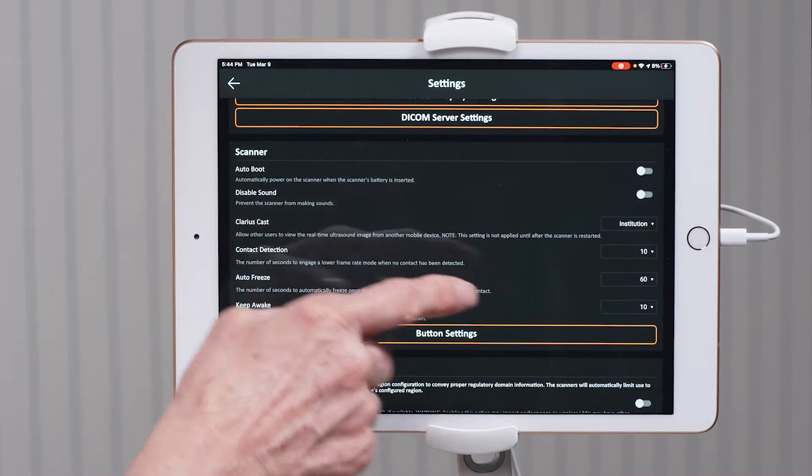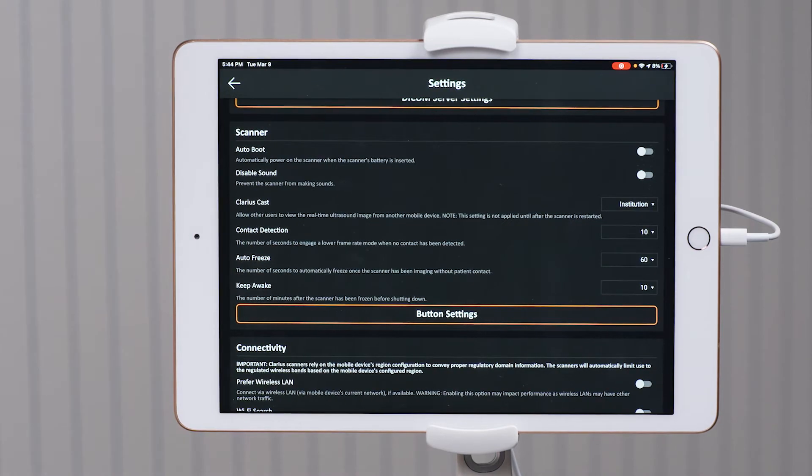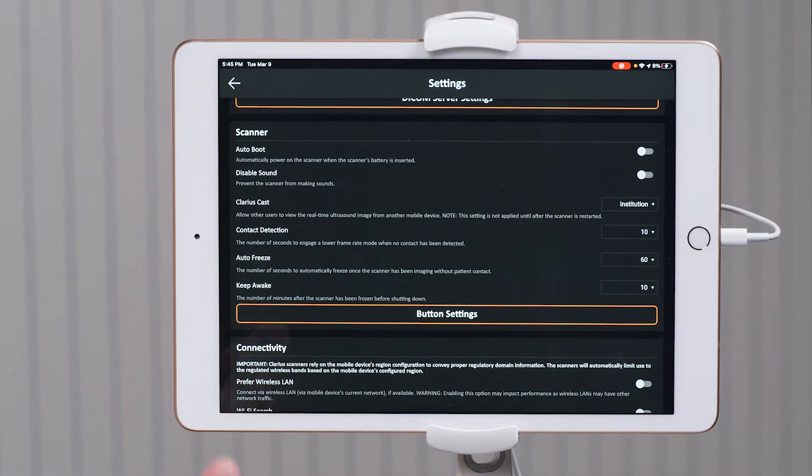I'm going to continue to scroll down to the scanner section. A few of these are set up so that your battery will last the longest. The first one I recommend being off is auto boot. What auto boot does — as soon as you insert your battery, the scanner automatically activates and you can begin scanning. However, I recommend auto boot be turned off so that your scanner's battery lasts longer. When the disabled sound is off, that means when you insert the battery you will hear a beep beep sound, and I like to hear that so I know the battery has engaged.